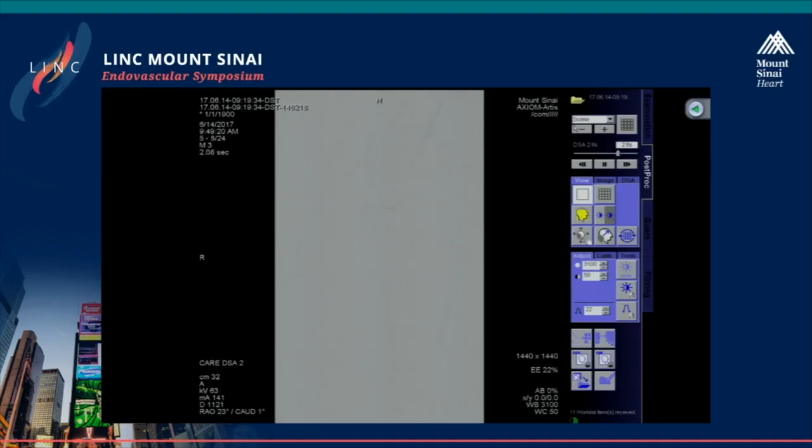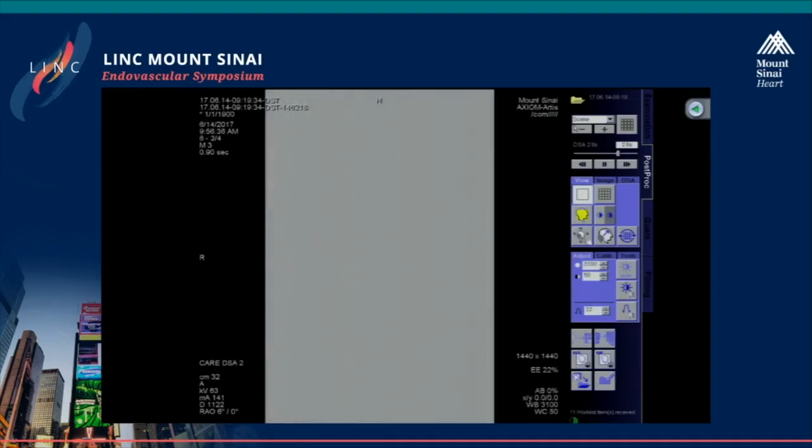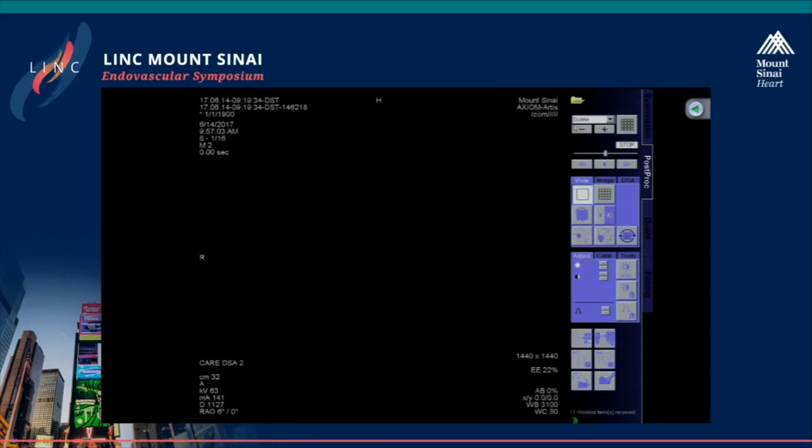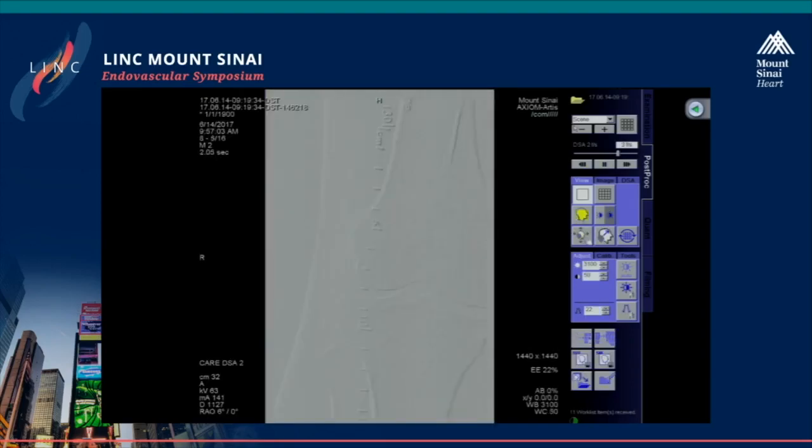And what we normally do once we take our diagnostic is take a catheter with an angle. This has really helped us. You can see the angled catheter right there to actually steer away from the collaterals. Hopefully I inject here. I know she was moving a little bit with pain. Nope, we didn't inject here either. Probably the next one. Here we go. I can tell you, when we injected, you can start to see a little bit more definition of what's happening to the vessel.